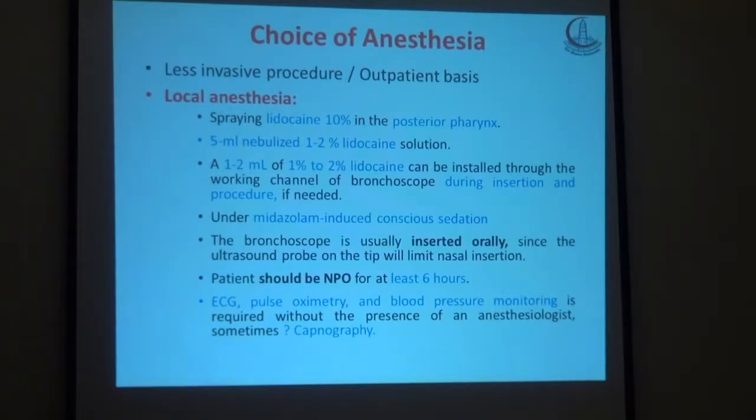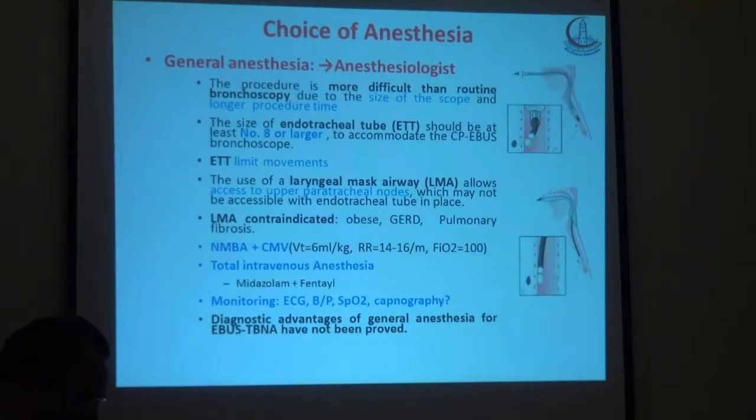كابنوجرافي، لو عندك القابلية إنك عندك كابنوجرافي، ممكن تستخدم كابنوجرافي، بس براكتيكلي بيزنس ما حدش بيعمل كابنوجرافي في الايبوس. الجنرال انستيزيا طبعا أفضل وأسهل والعيان بيبقى مستريح والاوبريتر مستريح والدنيا بيس، لكن طبعا بتعرض العيان إنك بتعمل له منظار دياجنوستيك تحت جنرال انستيزيا كأنه بيعمل عملية، فدي برضه تبقى من كونسيدريشن.